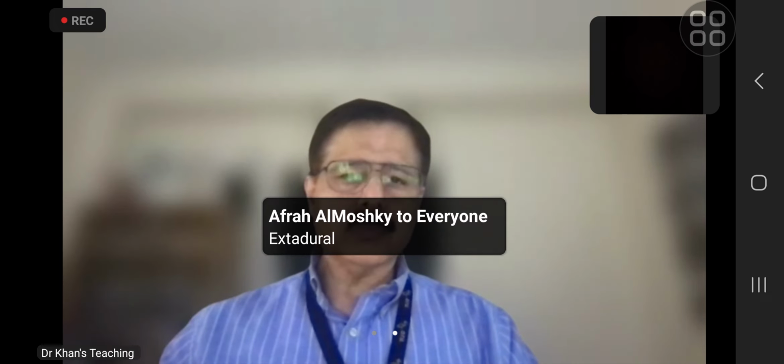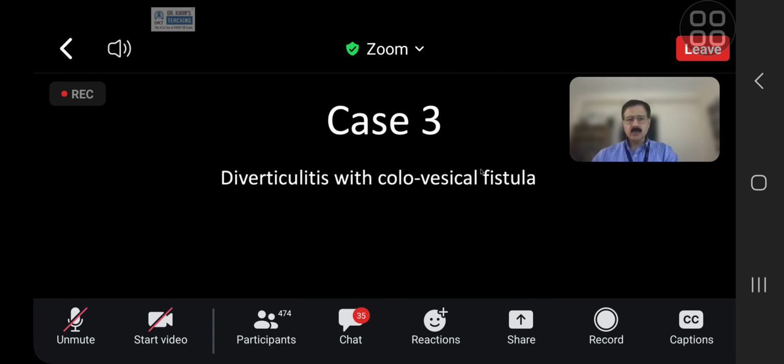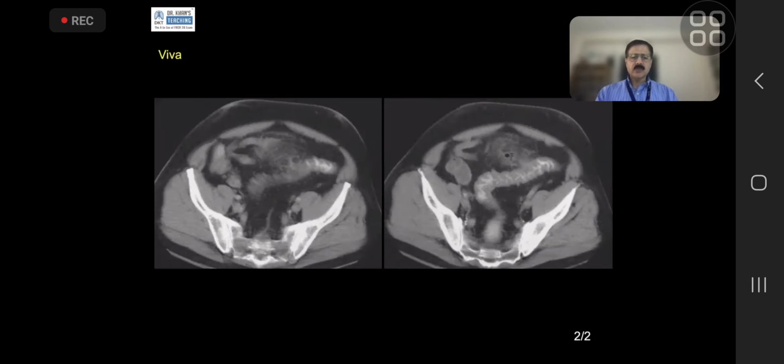Now, this is a case of diverticulitis with colovesical fistula. I'll go through the case subsequently. Now, please remember, diverticulitis is an extremely important condition for the exam, and there is a spectrum of findings which can come in the exam.